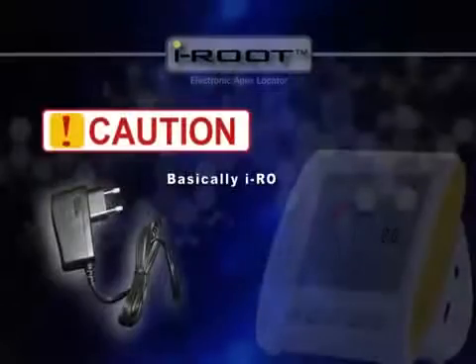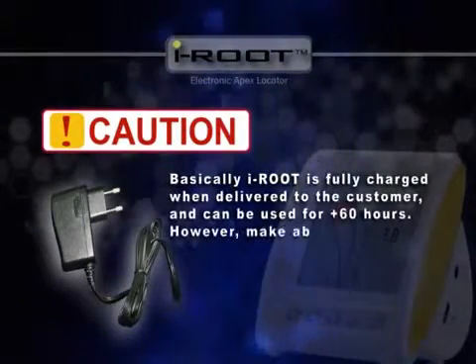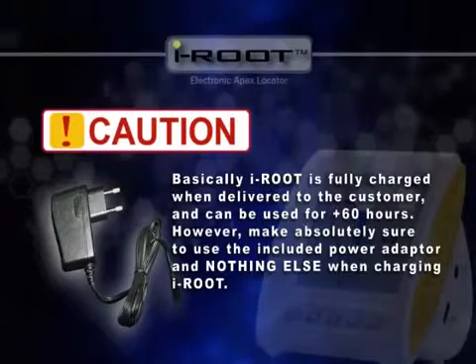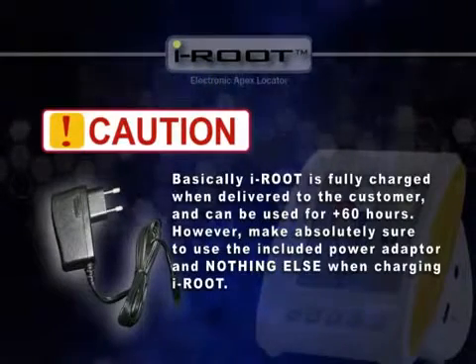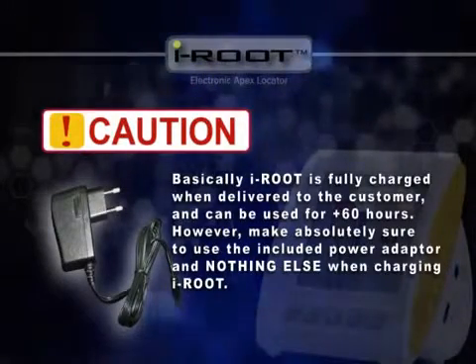Things to keep in mind when using iRoot: one power adapter is included in the package for charging the lithium-ion battery. iRoot is fully charged when delivered to the customer and can be used for over 60 hours. However, make absolutely sure to use only the included power adapter when charging iRoot.